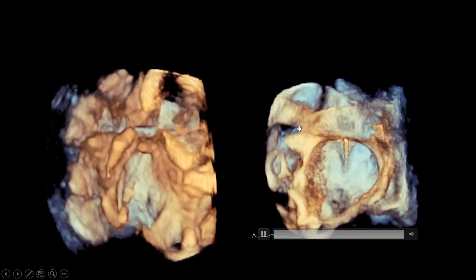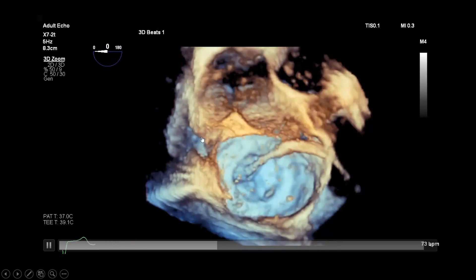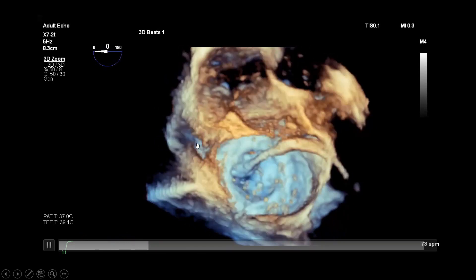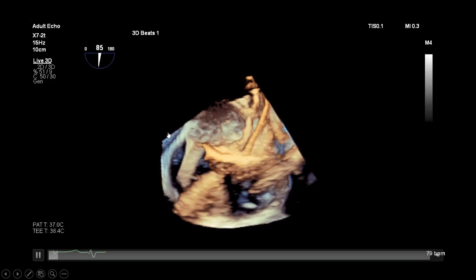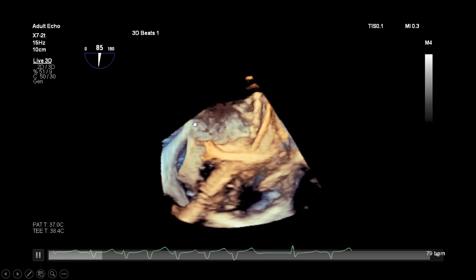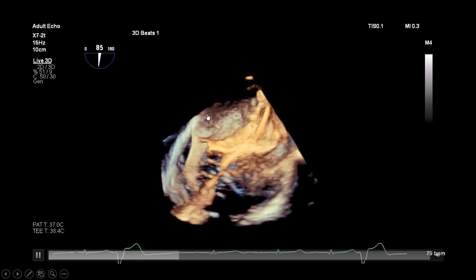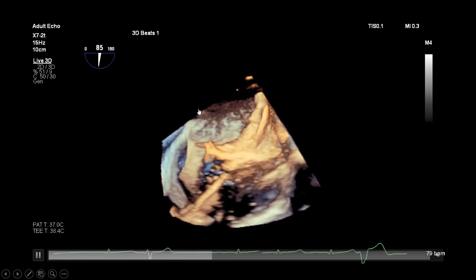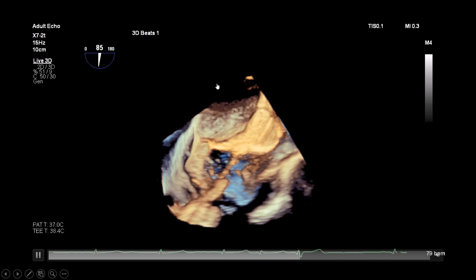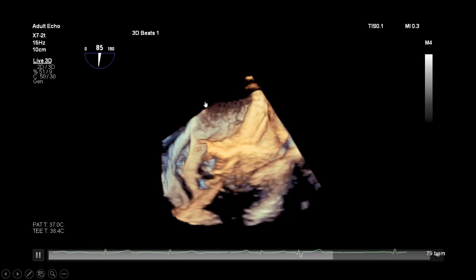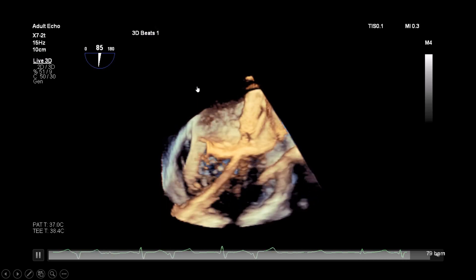These are the pulmonary veins. Now introducing the catheter into the mitral valve with the wire, you can see it starting to separate one of the commissures. Then puncturing with two wires to help stability, and passing balloons and other equipment. The crimped Edwards SAPIEN prosthesis is passing through the septum — this septum needed to be dilated first with a balloon. The balloon carrying the prosthesis is now passing through the interatrial septum. We wait until the whole valve is inside the left atrium before starting navigation.